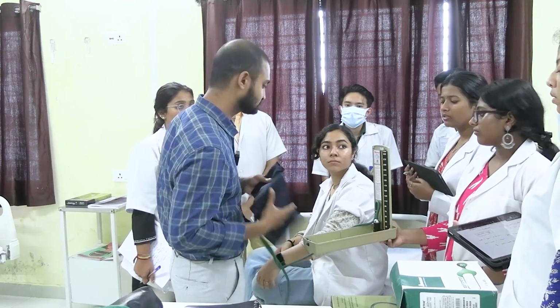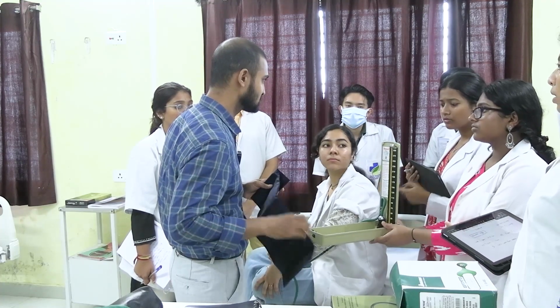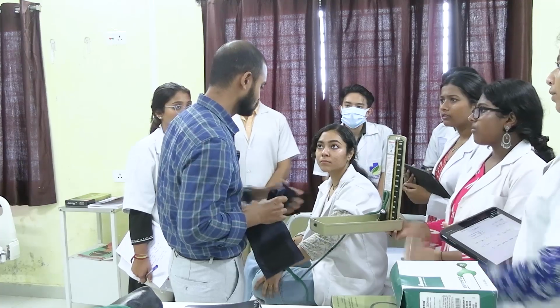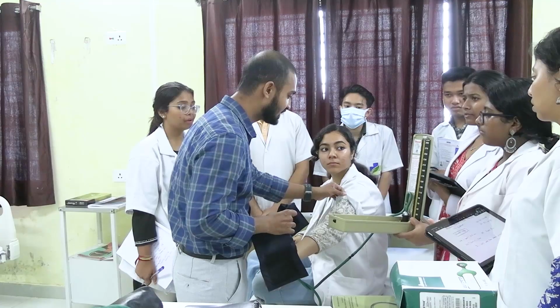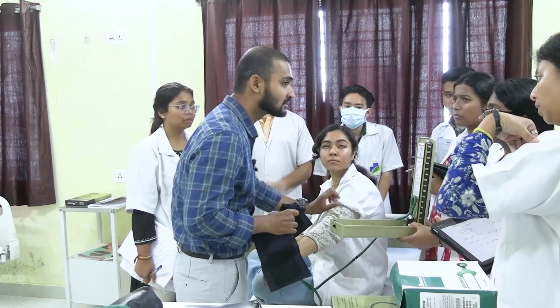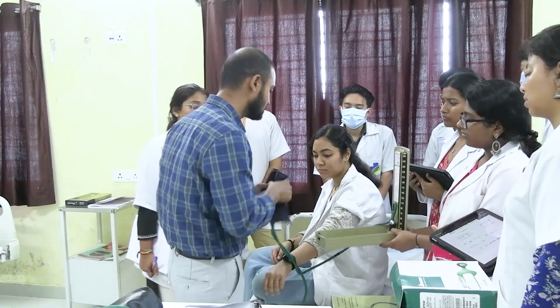What will happen? The diameter will increase. Some sort of pressure will be exerted on the upper part. It will reduce the pressure. I am talking about this cloth. You shouldn't fold it like this. Why? It will tighten up. Yes, it will give more pressure, na? It will give more pressure.